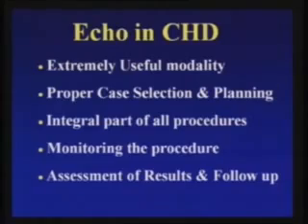We can stop here. The important thing is this: in congenital heart disease, we should follow a systematic, sequential approach. Whatever the lesion, whether it is a simple ASD, VSD or PDA, or a complex heart disease, if you go sequentially, you can diagnose any complex problem, or you can assess the hemodynamics of that particular heart defect.